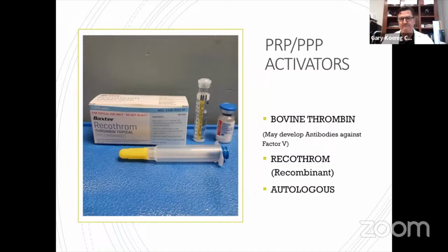The calcium actually binds the citrate, the anticoagulant. So when it's sprayed on, the calcium reverses the anticoagulation. And once the thrombin crisscrosses with a high concentration of platelets, that's when you have the release of the alpha-granules of your growth factors and cytokines and anti-inflammatory mediators.